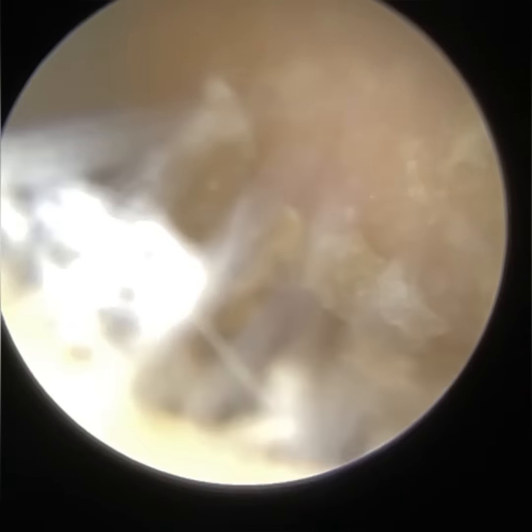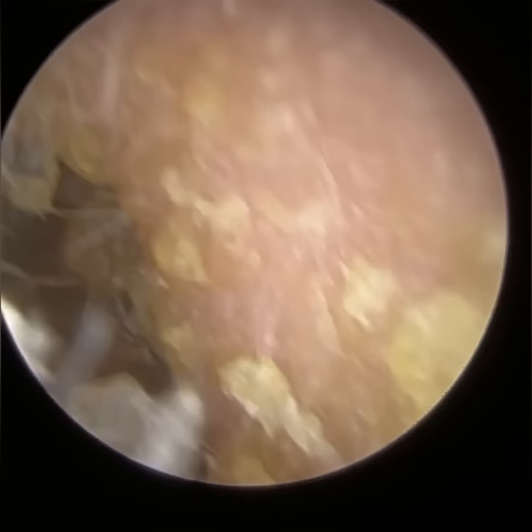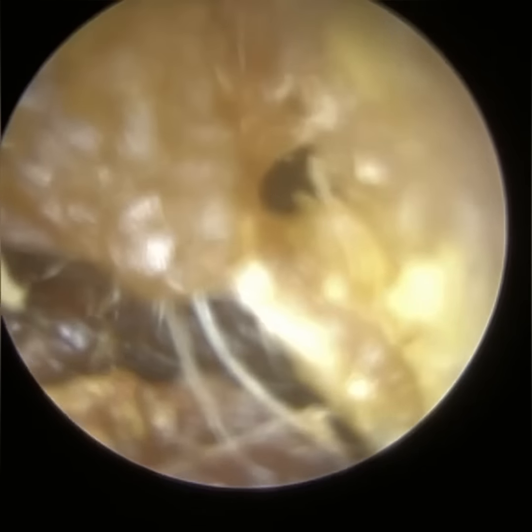Otitis externa is an infection or inflammation of the outer section of the ear — more namely the outer ear, which is made up of the outermost layer of the eardrum. The eardrum is three membranes thick. The lateral membrane, so the membrane facing us, is lined with a layer of epidermis skin — the same skin that lines the bony part of the ear canal.